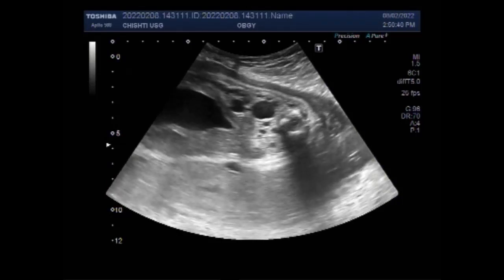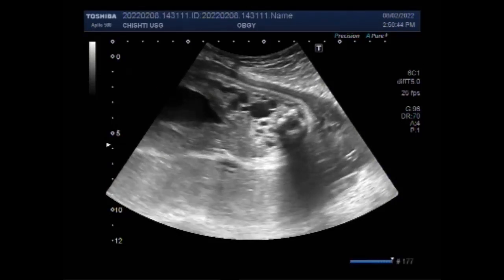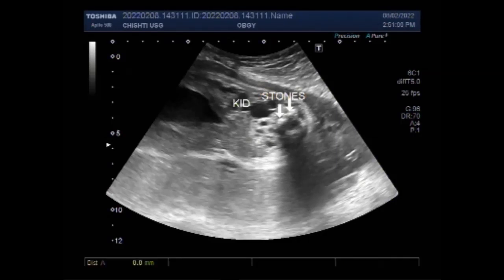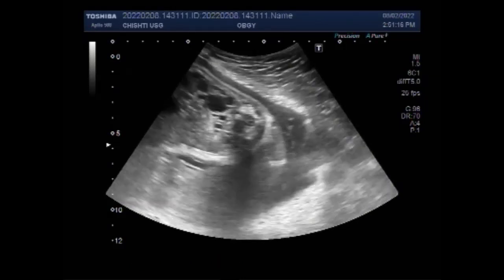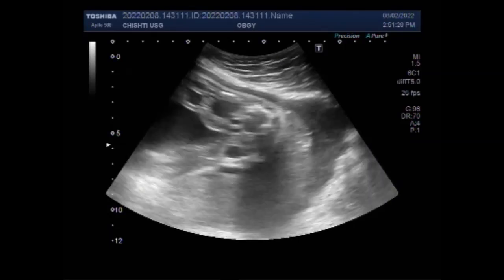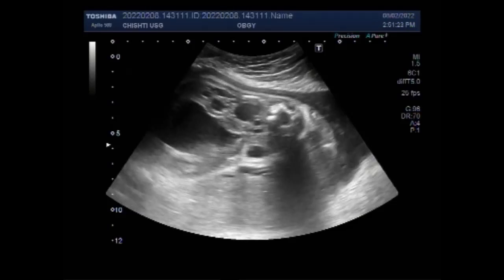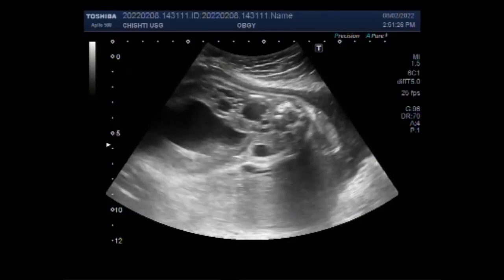Now you can see the other stone also. Both stones are seen in the upper pole of the kidney, and cysts are also seen. These are the two stones. Antenatally, diagnosis of renal calculi is extremely rare. I present a case of renal stone formation diagnosed at 30 weeks of gestation on ultrasound examination; two stones are seen in the upper pole of the kidney.